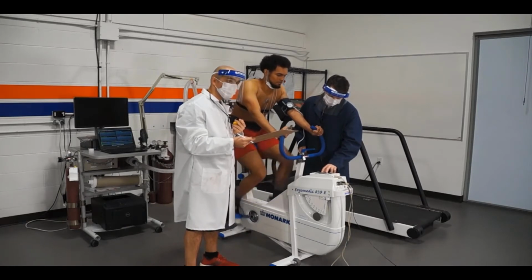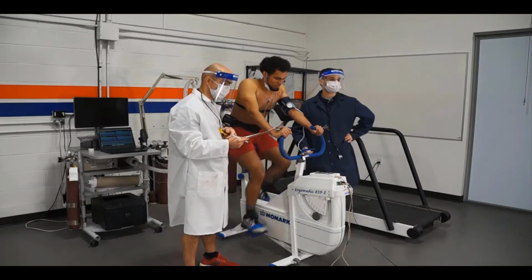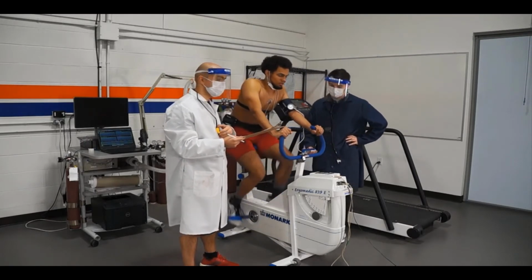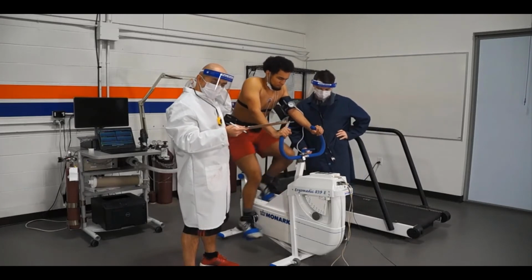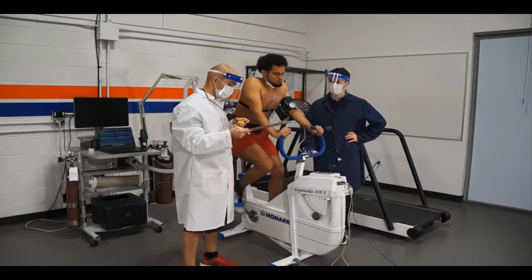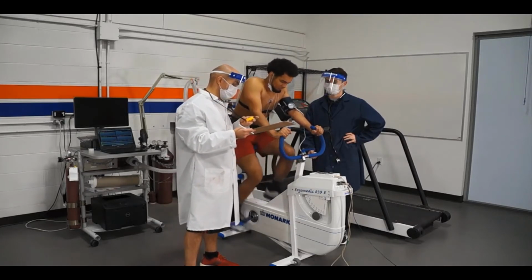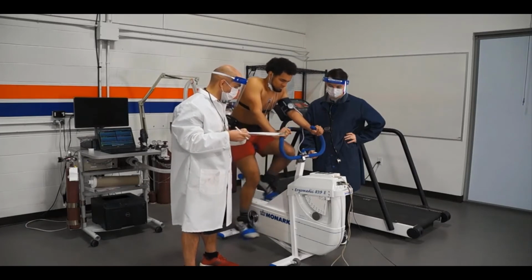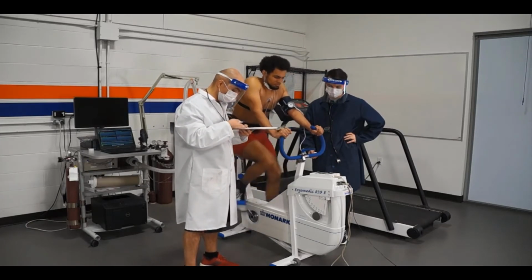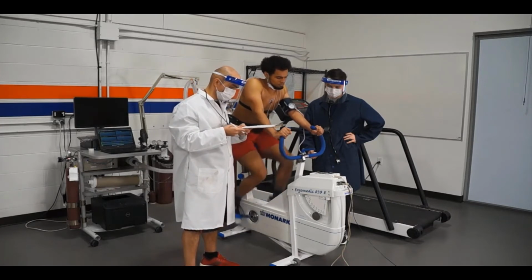And it doesn't look like much when you see somebody do it who's fairly practiced, but really not having to take double or triple measurements and getting accurate measurements is really, how should I say this, the part of an indirect test that sort of goes unnoticed or doesn't really get practiced until you do it once and you see, oh yeah, I messed up that 10 seconds and that ruined the whole test.